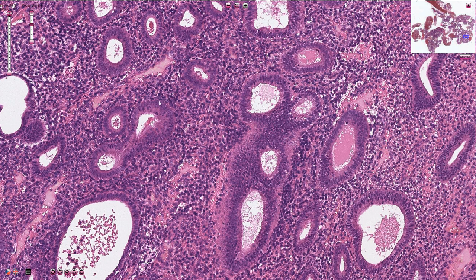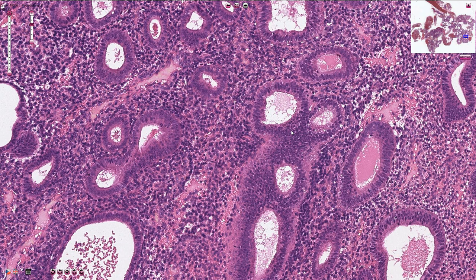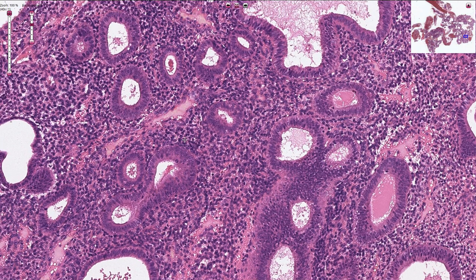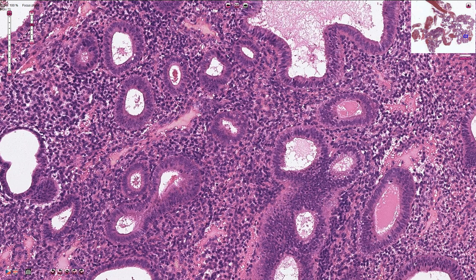On high magnification we can see proliferation of these endometrial proliferative type glands and the epithelium is pseudostratified. It has mitotic activity and looks like normal epithelium in the proliferative type of endometrial glands. There are no prominent epithelial atypical features.